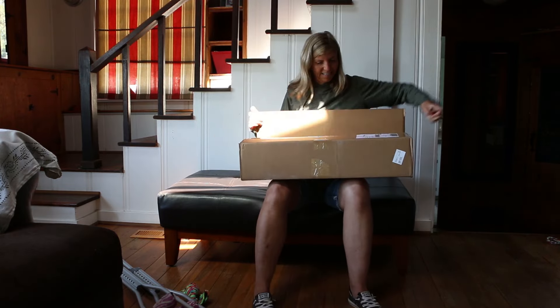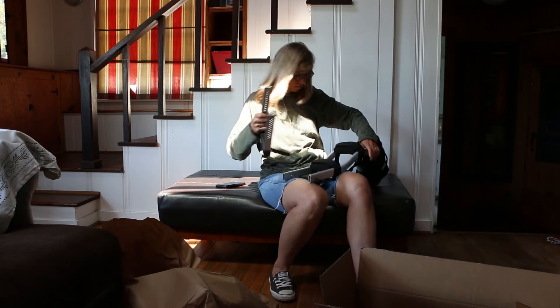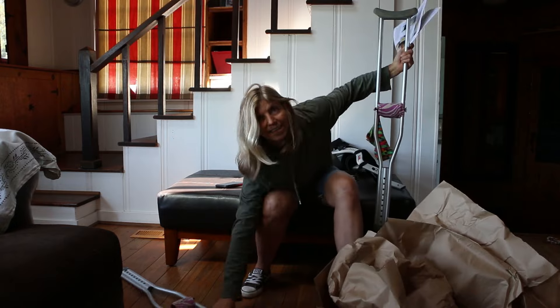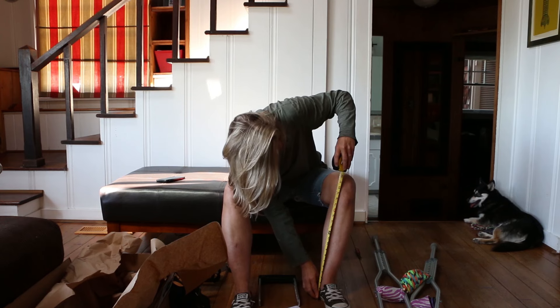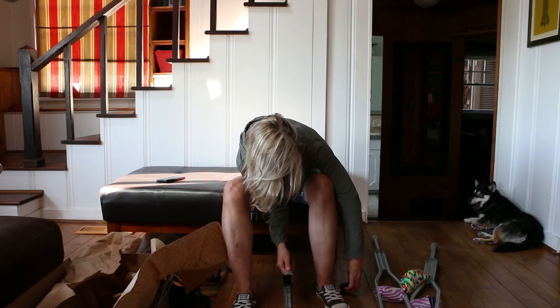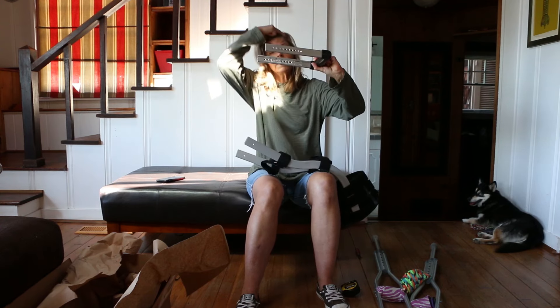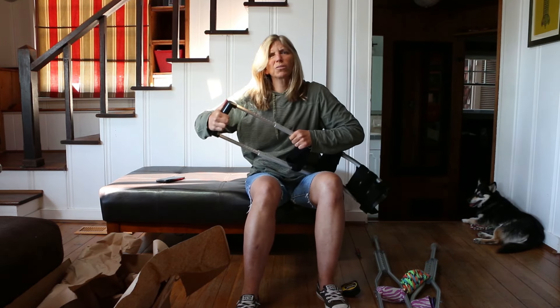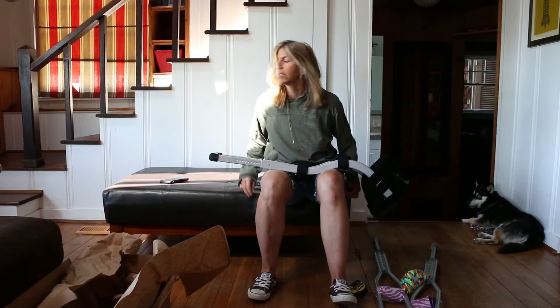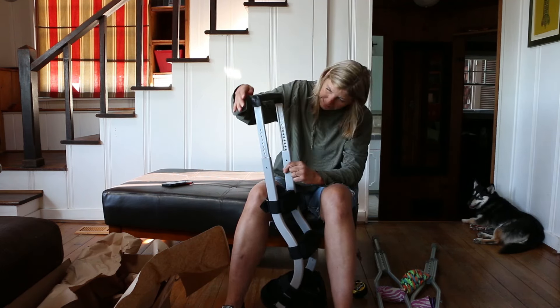Of course I need a measuring tape. It says: while wearing the same footwear — I'm not wearing heels anytime soon — sit with your foot on the floor and measure from the floor to the top of the knee. Okay, it's not sliding... hmm, that's not good.